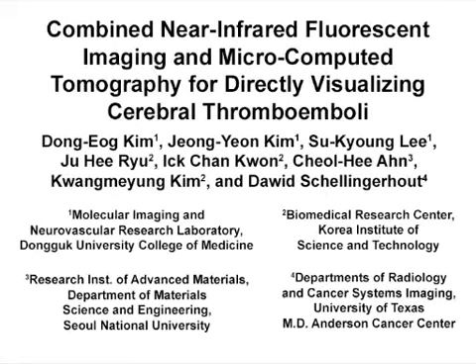The overall goal of this direct thrombus imaging technique is to quantitatively visualize fluorescently labeled cerebral thromboemboli in vivo and ex vivo using gold nanoparticles, computed tomography, and near-infrared fluorescent imaging. This method can help answer key questions in the hemostasis and thrombosis field, such as time or dose-dependent and serial therapeutic response of cerebral thromboemboli to tissue plasminogen activator or new thrombolytic agents under investigation.